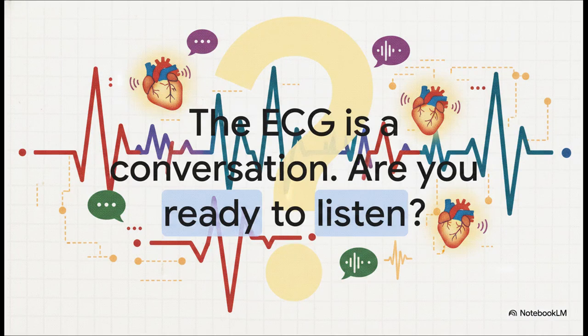So, you see, that jumble of squiggles is no longer a code to be cracked. It's a rich, detailed conversation that the heart is having with you, beat by beat, moment by moment. The only question left is, are you ready to listen?